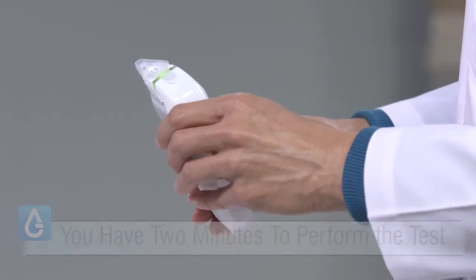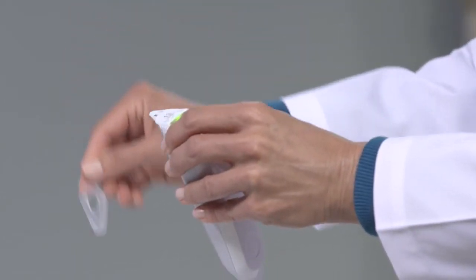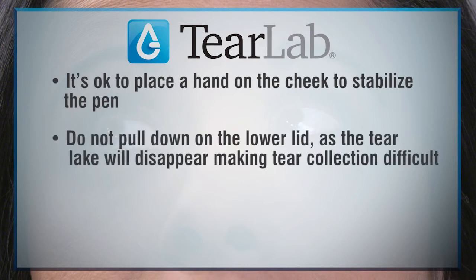Securing the wings of the test card with one hand, pull up with the other hand to remove the protective cover. Approach the patient from the side. Position the patient with their chin tilted upward and their eyes directed toward the ceiling and away from you. Remind the patient to blink normally. It's okay to place a hand on the cheek to stabilize the pen, but do not pull down on the lower lid, as the tear lake will disappear, making tear collection difficult.